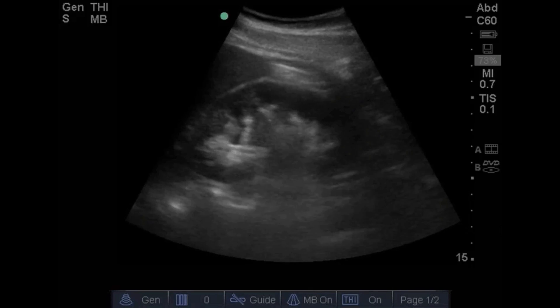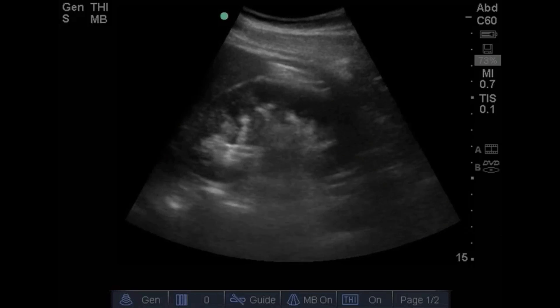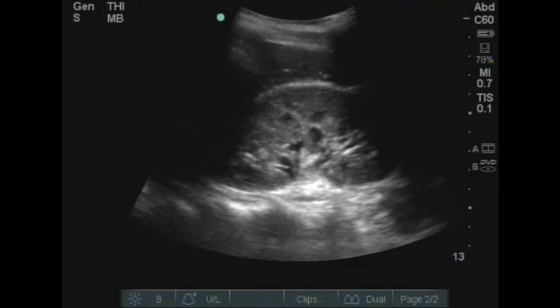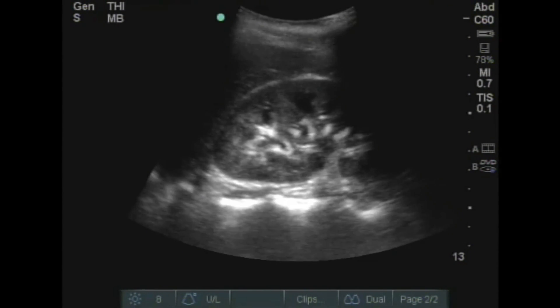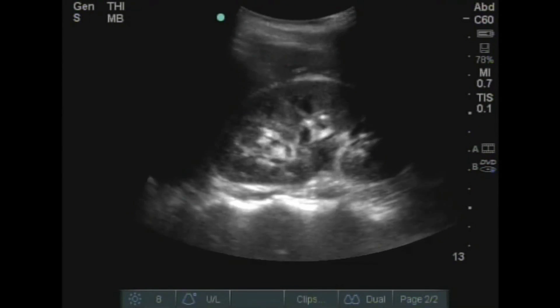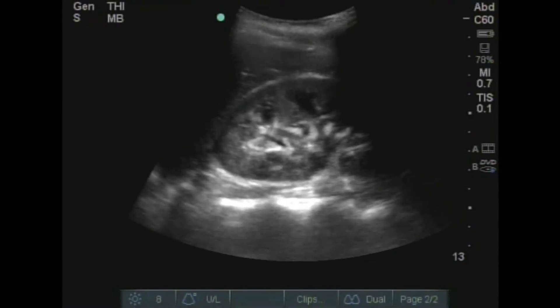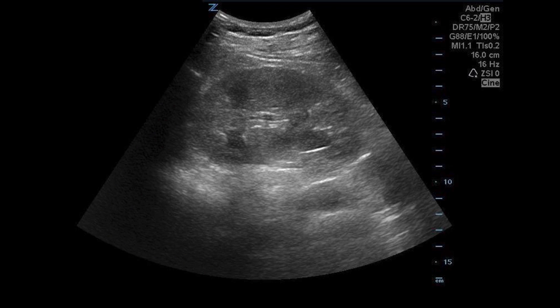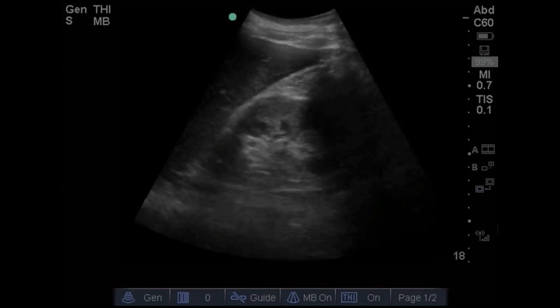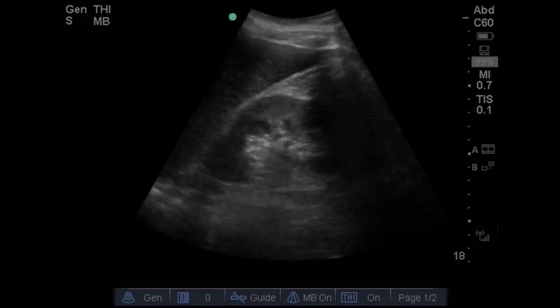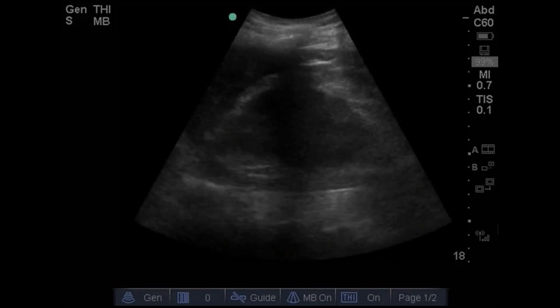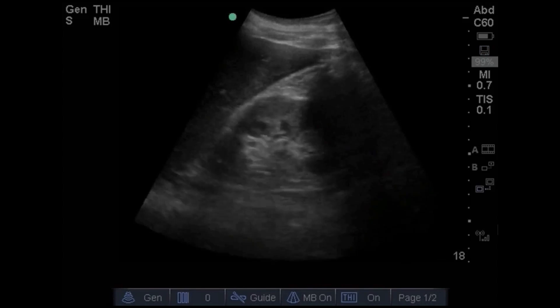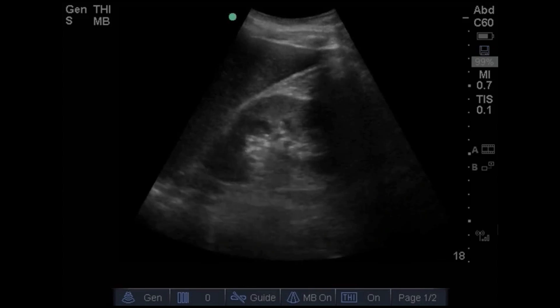Another option is having the patient breathe shallowly, as there may be little kidney movement. On the sagittal view, focus on evaluating the renal pelvis where the collecting system and ureter are, to assess for the presence or absence of hydronephrosis. You must see the renal pelvis to evaluate the collecting system, and ensure it's not obscured by rib shadow — which may require the patient to breathe in or out to move the pelvis clear. You can see the ureter, collecting system, renal pelvis, and calyxes. Renal pyramids appear as hypoechoic structures in the parenchyma. Scan from when the kidney appears to when it disappears to ensure you've covered the entire organ.